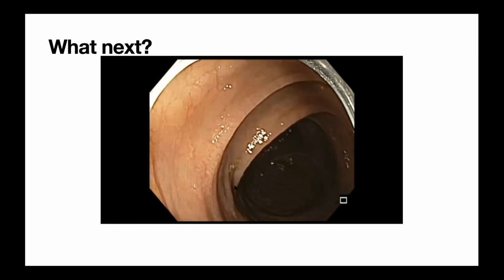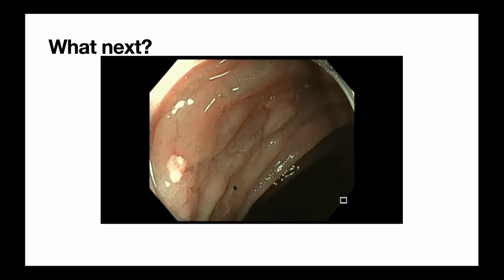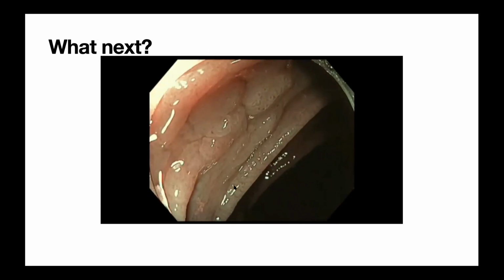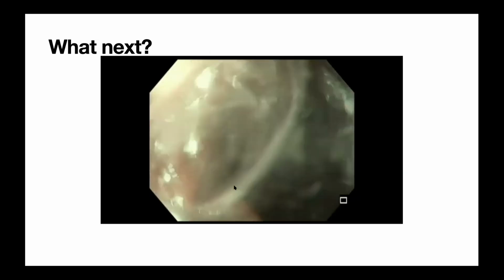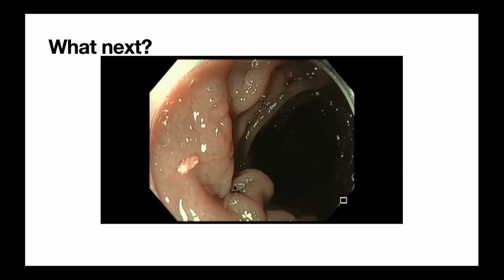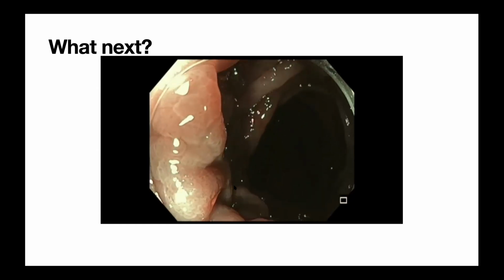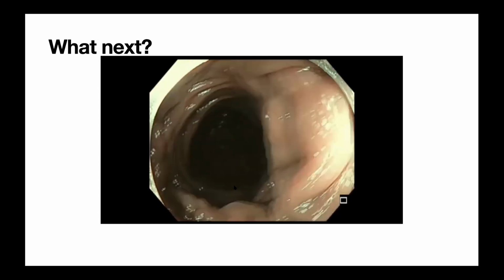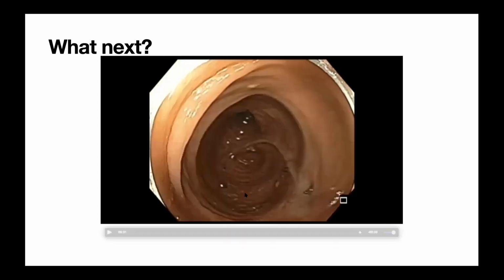So let me show you. And it's actually interesting to give you a little bit of perspective. We ran late that day. And by the time I started this procedure, it was 5:30 in the evening. And when you see a lesion like this at 5:30 in the evening, after having started your work at about 7 o'clock in the morning, you wonder what's going on in your mind, right?